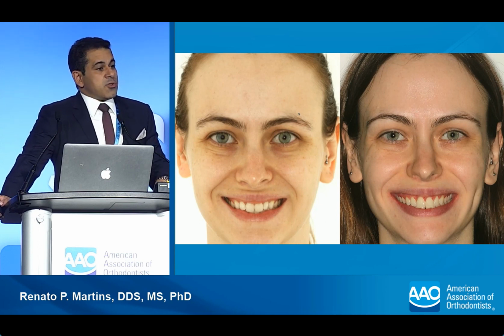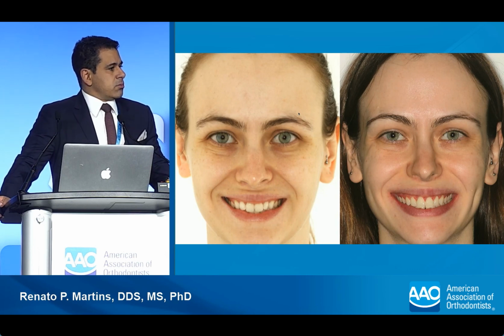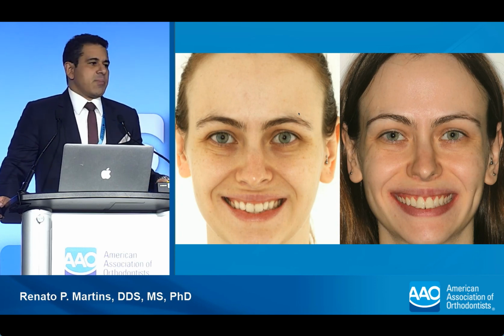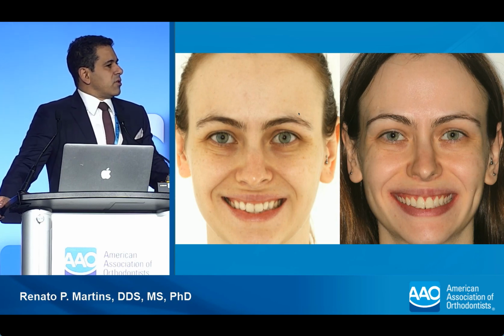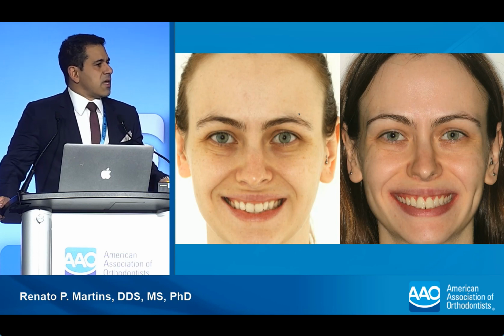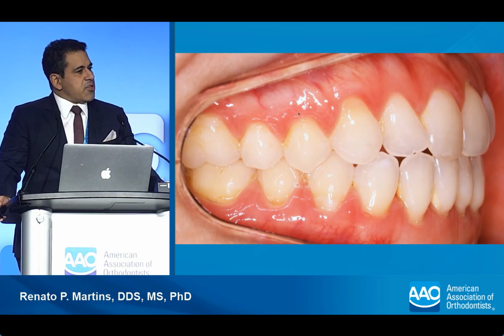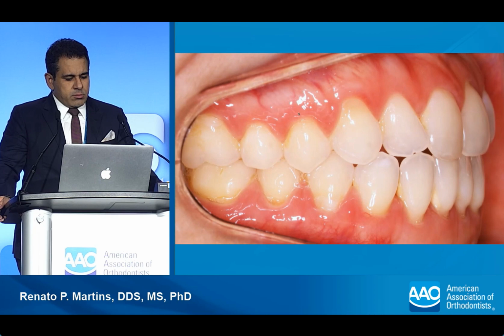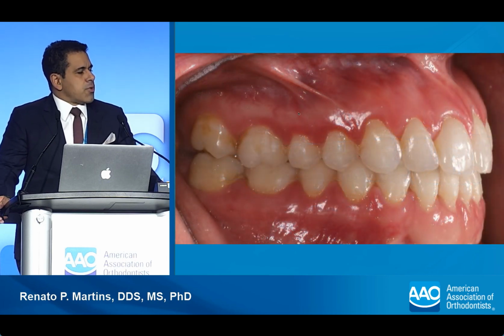So this is what we call hybrid mechanics. You need to identify movements that aligners are not very good to do, and you can substitute in a part of the treatment, which can be in the beginning or it can be during the treatment, with fixed appliances. That's what you should do whenever you know that aligners are not going to resolve a kind of movement that you need to obtain to finish a case of your patient. So again, in her case, we need proclination and extrusion. This is month 3. And this is her finished with the hybrid mechanics.